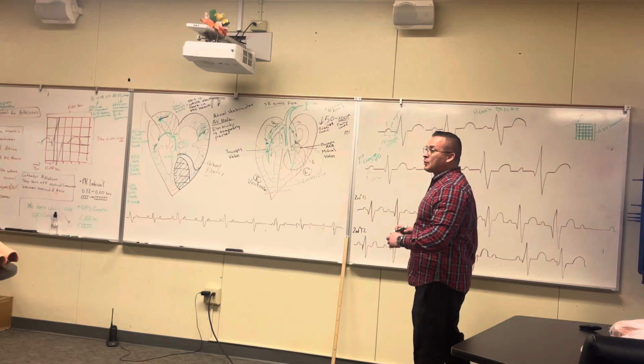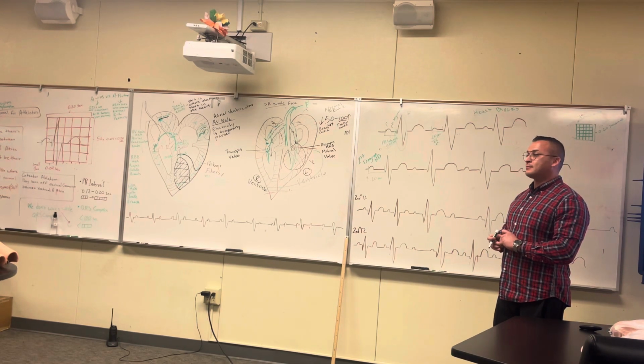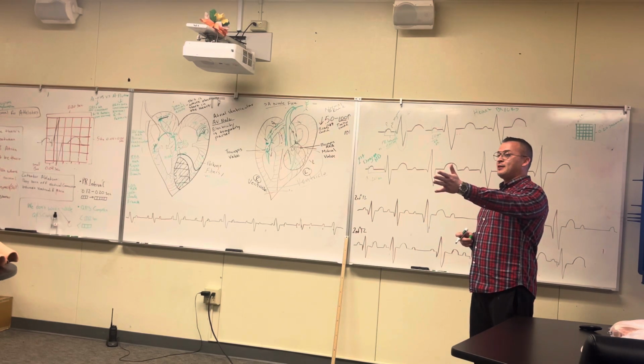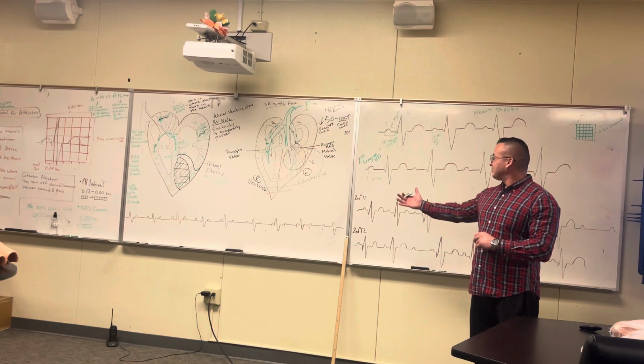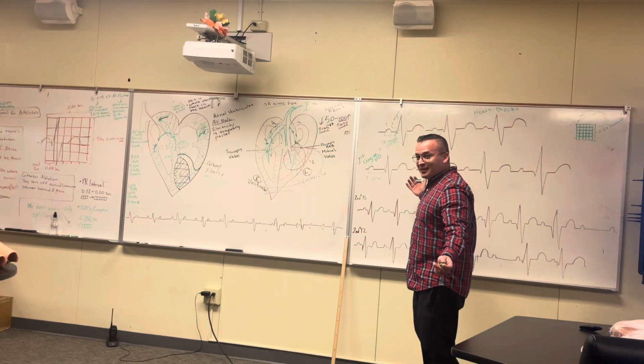I have a first degree heart block, Freddie, what does that mean to you? We talked about it. It's more than 0.20 seconds. That's it.